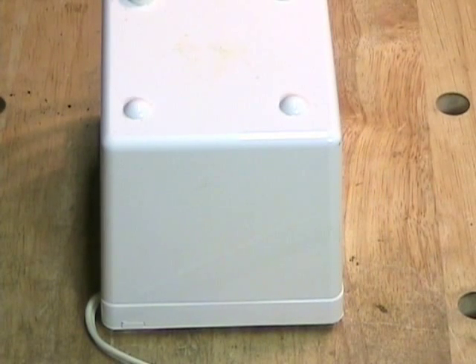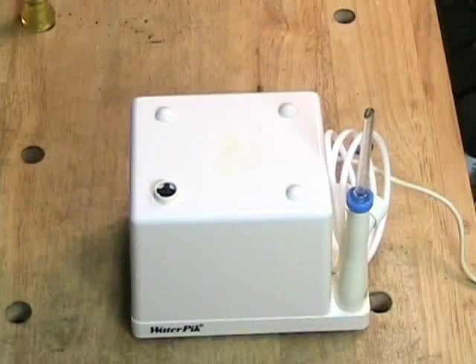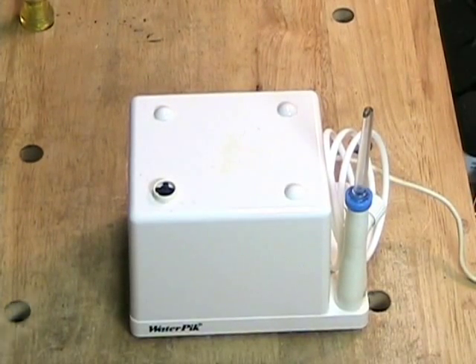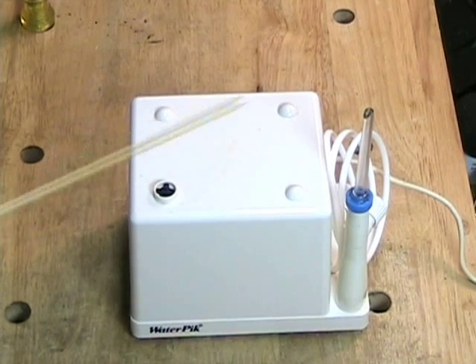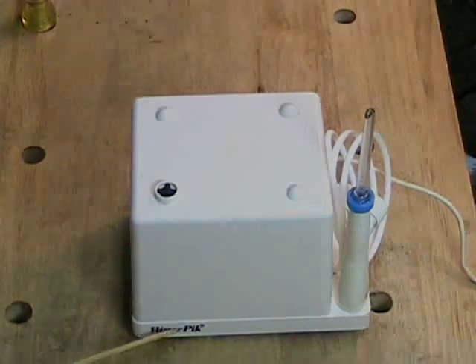Have you ever heard a sound like this? If that sound was familiar to you, congratulations — you are probably taking very good care of your teeth, because this is a device for cleaning your teeth called a water pick.